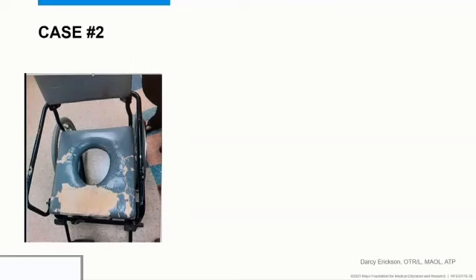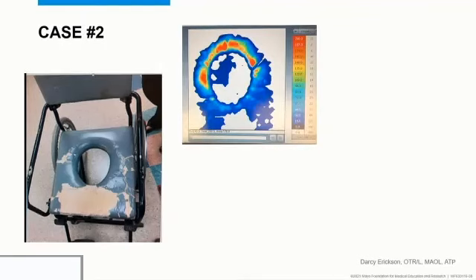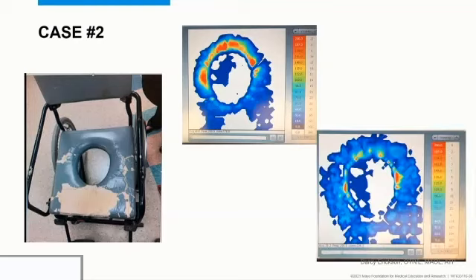And I was like, okay, all right, well, you're right, but that's really bad, and I think we can do a lot better. Of course, we had to wait for insurance coverage, so we did pressure mapping to prove just how bad it was, regardless of how it looked. Then we put in an air immersion overlay for the commode to help alleviate some of those symptoms in the meantime while we were working up to surgery, and then got him a new commode to use after the surgery so that we didn't have a repeat. But we talked a lot about the fact that when stuff looks like this, you should get rid of it before it looks like this, right?